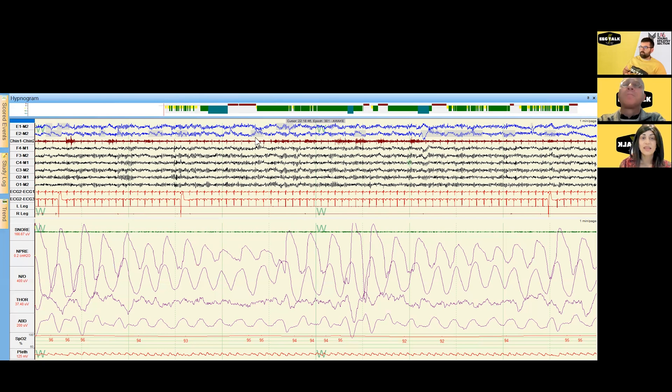This teal color represents delta sleep, or N3 — also known as deep sleep. The brown is stage R, or rapid eye movement sleep — REM sleep. Taking a bird's-eye view, the brain is cycling through different stages of sleep, which is good, but I do see sleep fragmentation throughout the night. The question is: is that due to a respiratory etiology, given the clinical suspicion for obstructive sleep apnea?